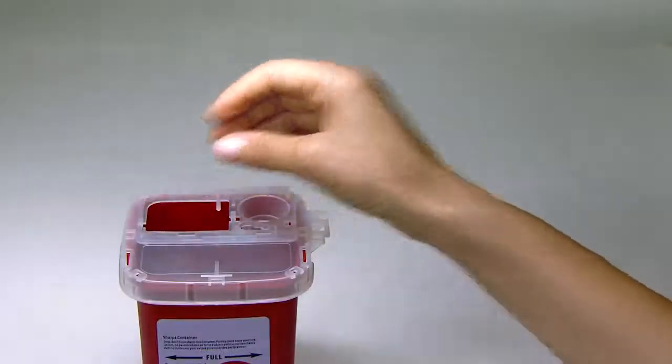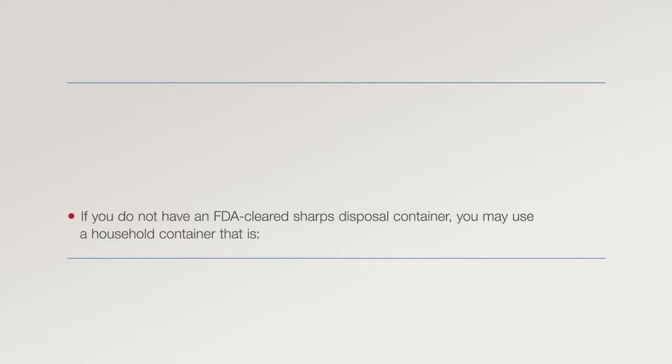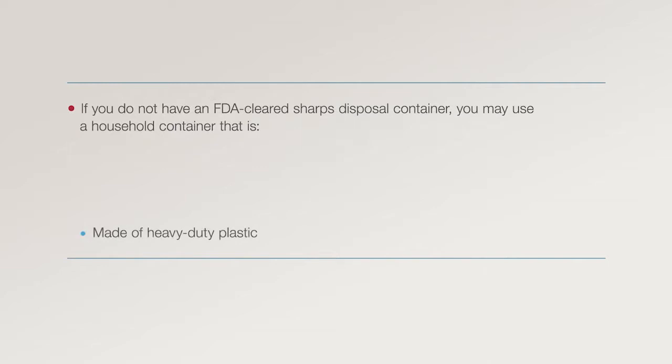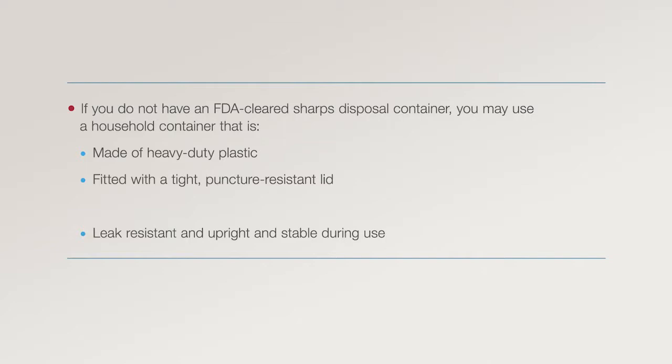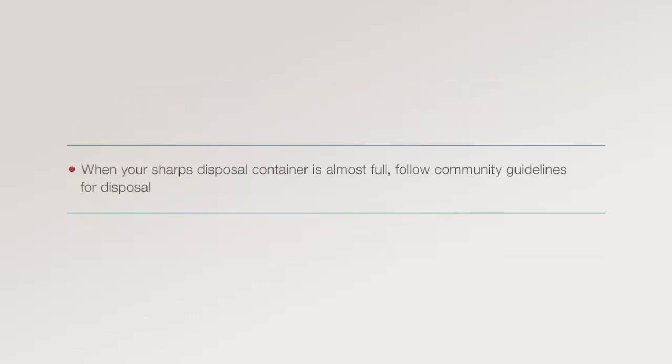Step 4. Disposal. Discard all syringes and needles in your sharps container. Do not throw away empty syringes or loose needles in your household trash. If you do not have an FDA-cleared sharps disposal container, you may use a household container that is made of heavy-duty plastic, fitted with a tight, puncture-resistant lid, leak-resistant, upright and stable during use, and properly labeled to warn of hazardous waste inside the container. When your sharps disposal container is almost full, follow community guidelines for disposal.